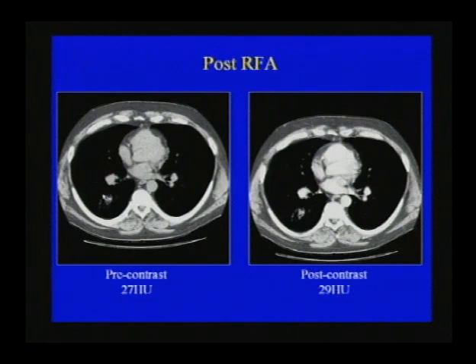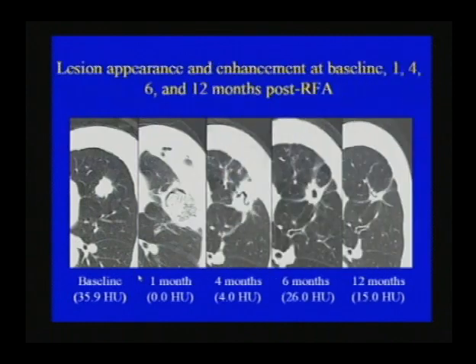And you already get a glimmer that in fact the area involved is a little bit bigger than the original lesion. But what you see is that pre and post contrast, the uptake profile is very much the same and not dramatically high. A little bit higher than the 15, but looks very much as though there is no real uptake compared to the 58 preceding. So it's the delta compared to the pre-treatment that's been reduced that we feel is an important indicator rather than just an absolute number. And here is the kind of visual impression you get.